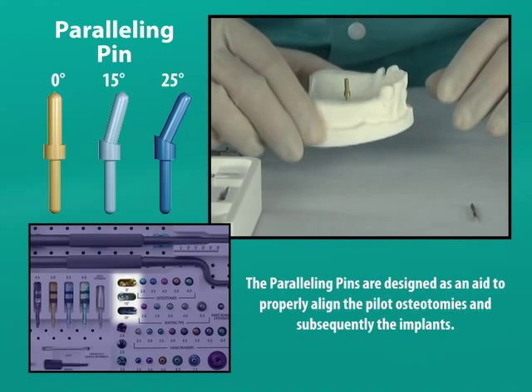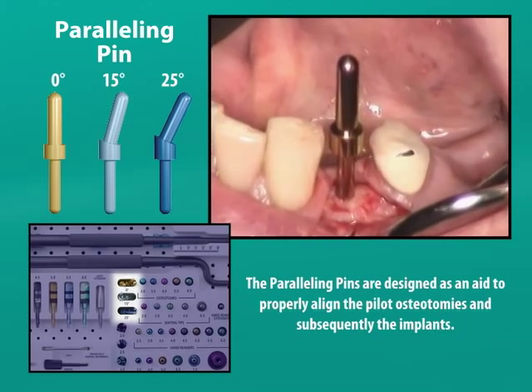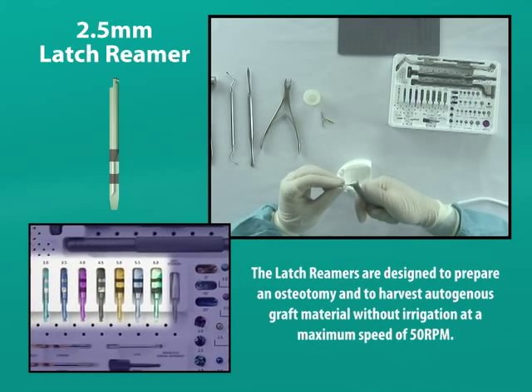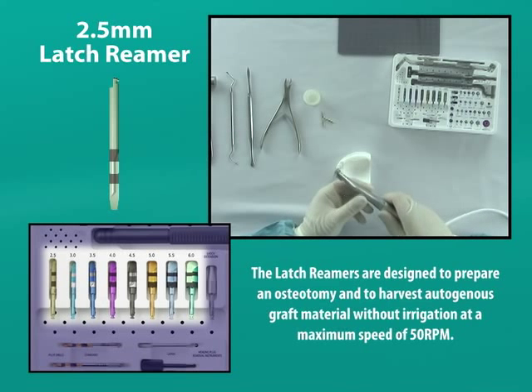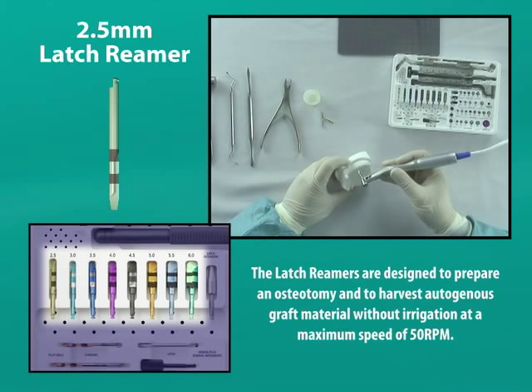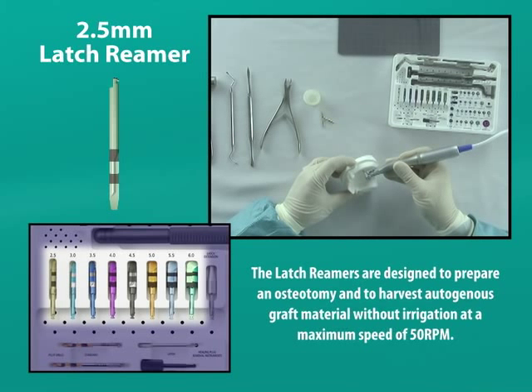The Bicon surgical kit contains 0 degree, 15 degree, and 25 degree paralleling pins. Once we are satisfied with the positioning of our pilot osteotomy, we will widen it to the width of the intended implant by using 0.5 millimeter incrementally wider latch or hand reamers. The latch reamers are used with a 400 to 1 reduction handpiece or comparable handpiece with sufficiently high torque to widen the osteotomy while rotating at only 50 revolutions per minute or less.